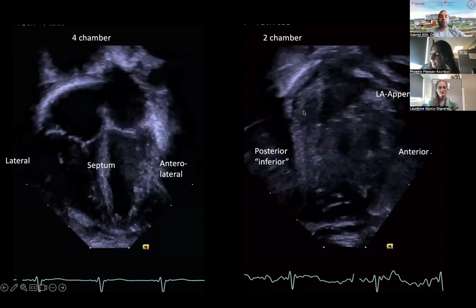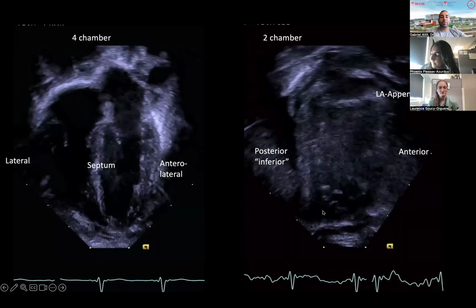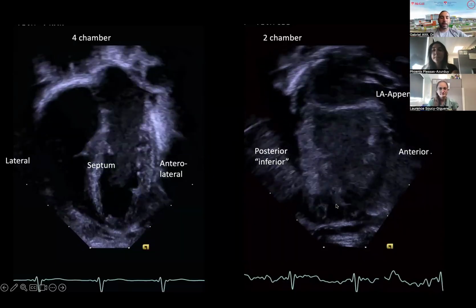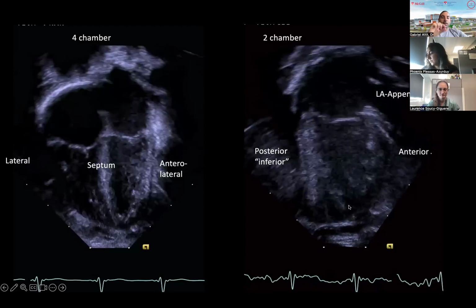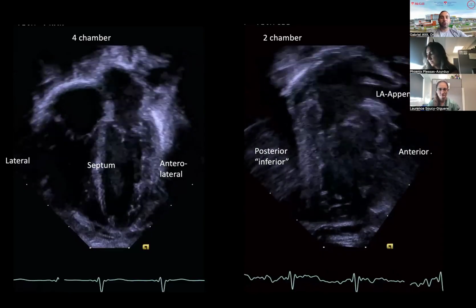And so you see here that you have a bit of the liver, the posterior wall of your left ventricle, the apex of the left ventricle. You see that little line, which we sometimes call the left ventricular tendon. It's really a fibrous line. It's not the moderator band, because if it was the moderator band, it would be the RV. How do you know? It's a very thin line that doesn't get thicker during contraction.